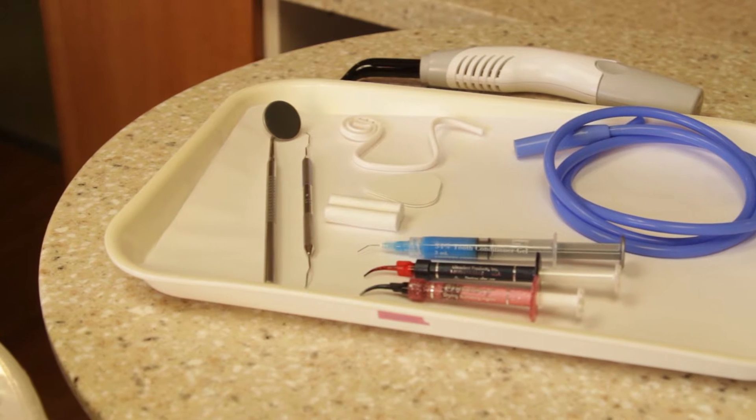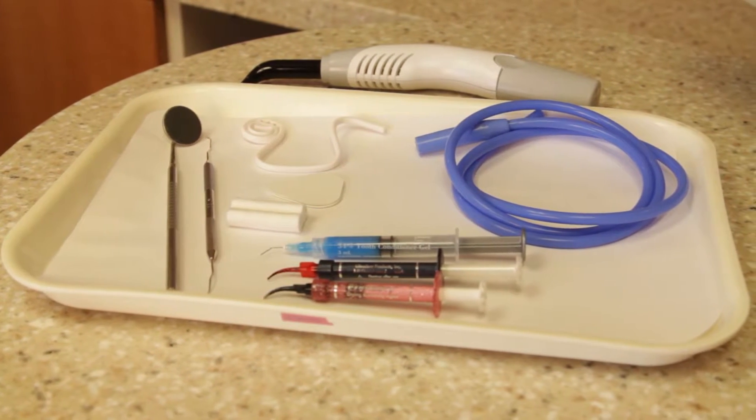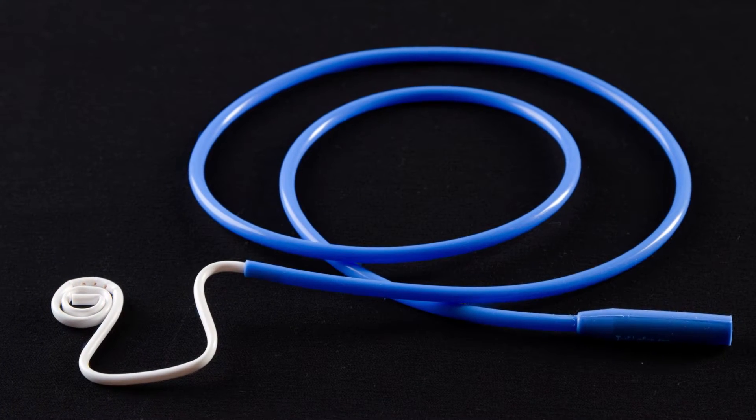Every clinician understands the importance of keeping an area dry in order to create an effective sealant. The BlueBoa adapter delivers superior isolation for procedures such as sealants.